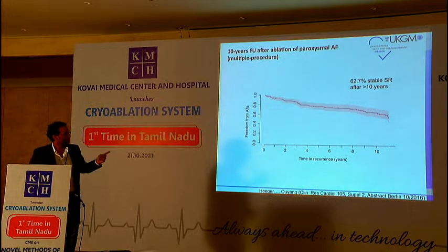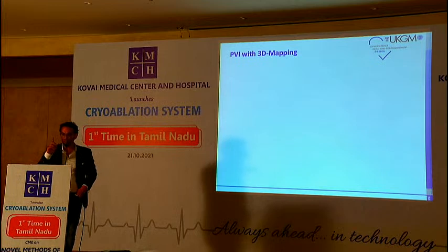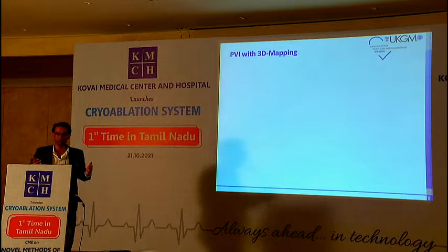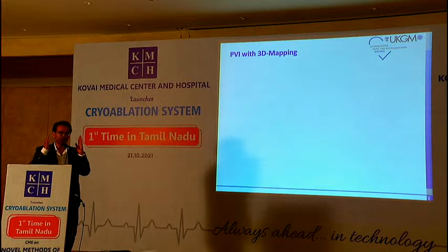In this study, one of the studies of my old hospital, after 10 years, 60 to 70% had stable sinus rhythm. And I think this is a pretty good result with, don't forget, long-term follow-up, 10 years, with old technologies. These patients were not treated with the newest generations of balloons or of 3D mapping systems. These are old generations and less experienced operators.